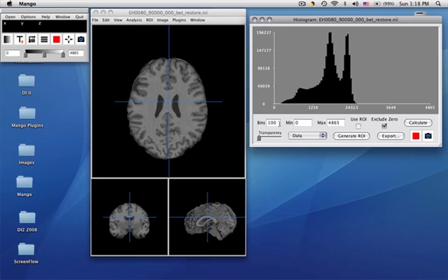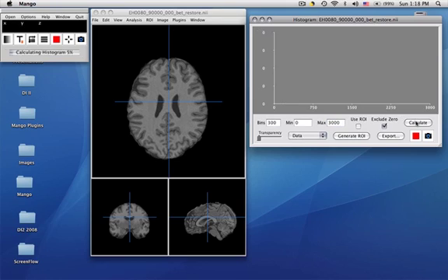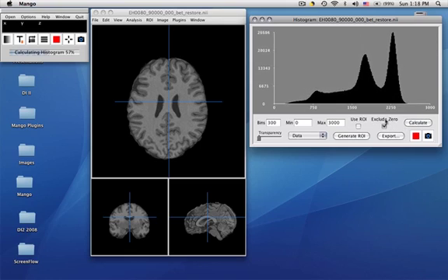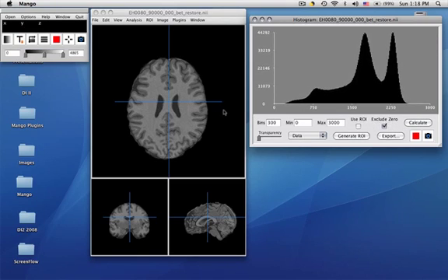To make this look better, I'm going to add more bins and decrease the range of it so we can cover the full graph a little better. And we'll recalculate that. Notice we're excluding the zero because there were a large number of zeros.